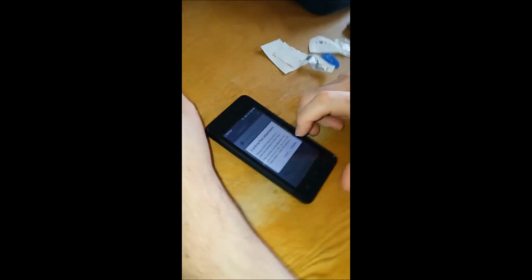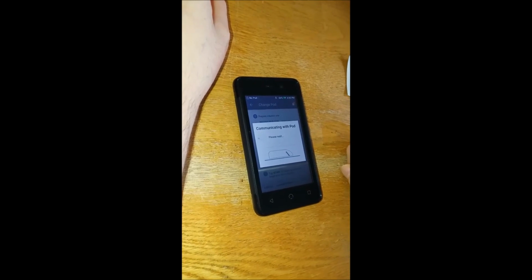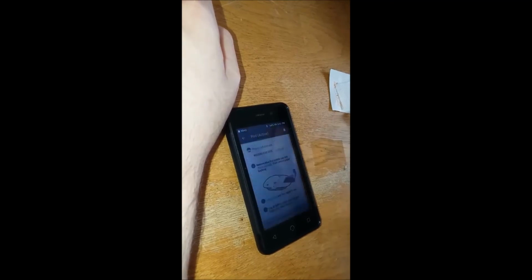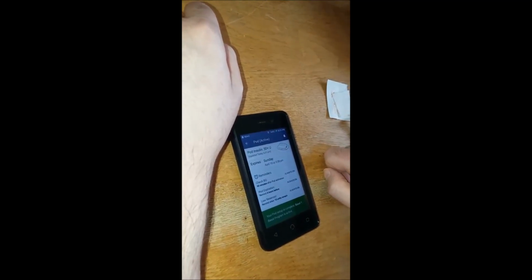Okay. So this device here gets everything going, and it works on Bluetooth. So I'm going to get it started, and it's going to insert the needle into my skin. And whoa! Oh no, I'm just joking. I'm kind of used to it. And there it's priming, and everything's in and set to rock. And with monitoring and staying active, eating healthy, I'll be healthy because of this cool little machine.